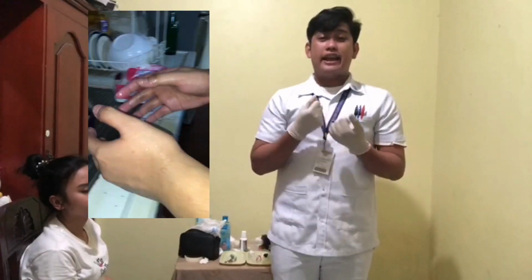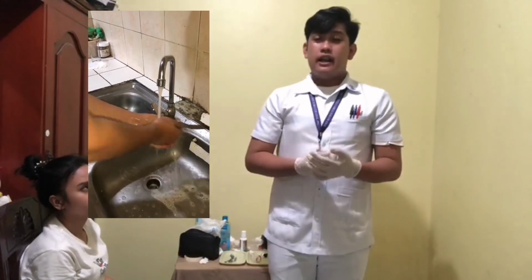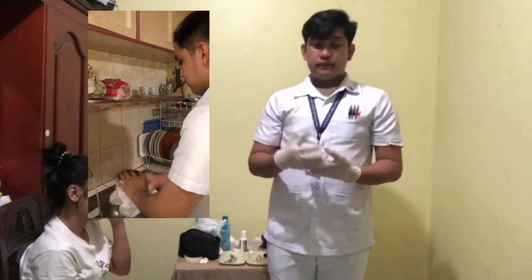So we have already done the general preparation and the preparation of the medication from ampules. So we can now start with the injection procedures. We'll start with the hand hygiene. Since I have already done applying hand hygiene, I am going to now prepare the client and introduce ourselves, as well as explain the procedure to them. We'll also explain the purpose and effect of the medication to make sure that our client is well aware and informed of the medication they'll be taking.